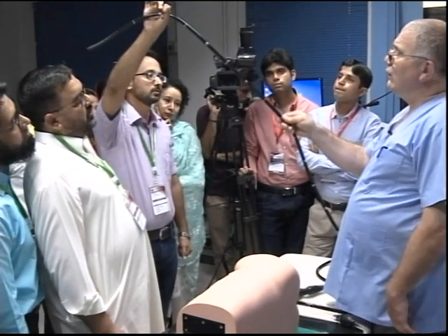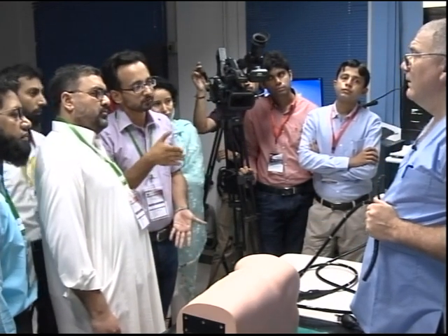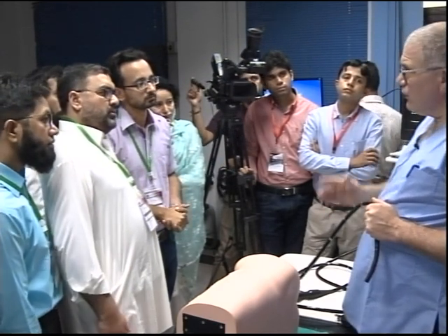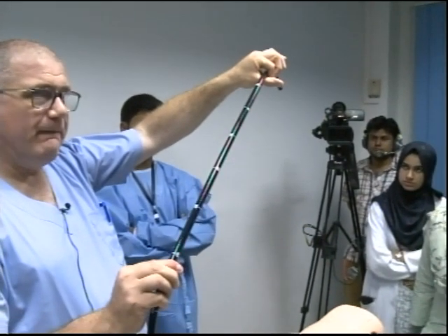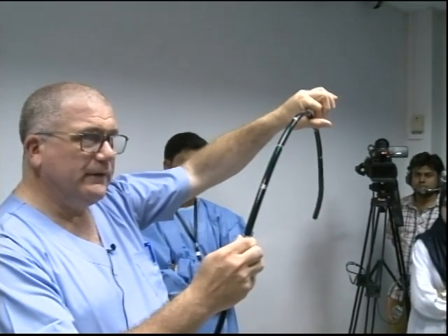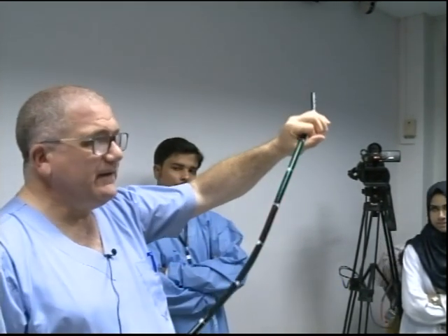So when we let the torque go, what am I actually saying to you to do? To go forwards, we have to stiffen the torque more. No, when you reduce your loop, I've reduced the loop, I've applied the torque, where I've finished, I then advance with that torque. If I let go of the torque, the loop will form again. The loop will form again. Doesn't matter if it's anti-clockwise.